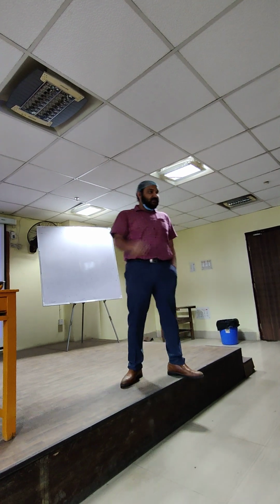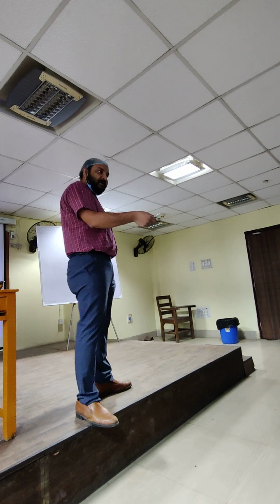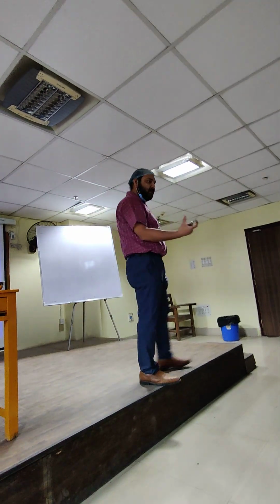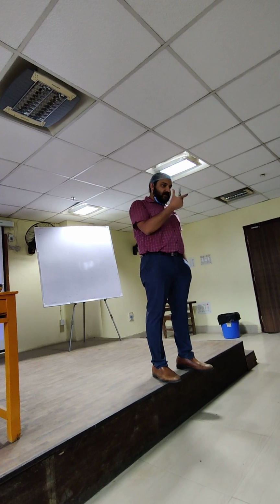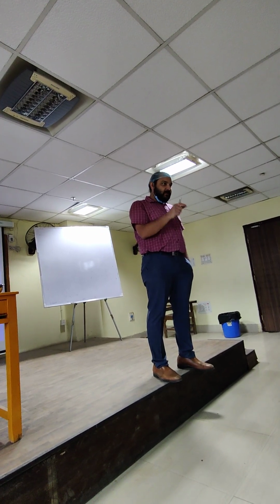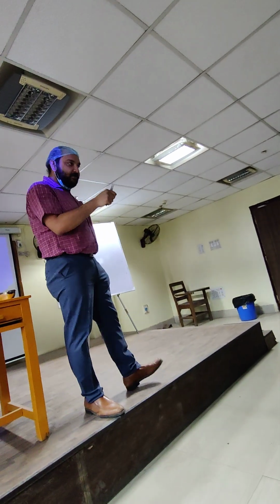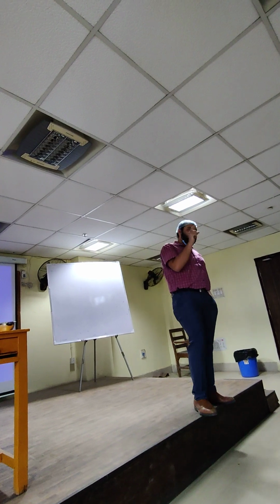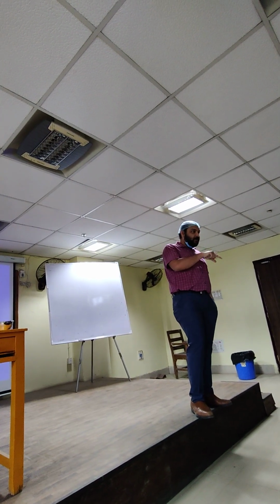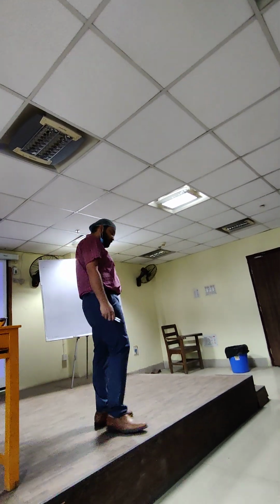Cortical plate expansion. The main principle is expansion of the bone. Once we are putting the apical pressure, the apical bone gets expanded. Then once we are giving the buccolingual traction, the middle part of the bone is getting expanded. And at last, we can give a little bit of figure of eight rotation, and that will cause the shearing of the periodontal fibers. Then we will take it out. And apical thrust should be maintained throughout the extraction.